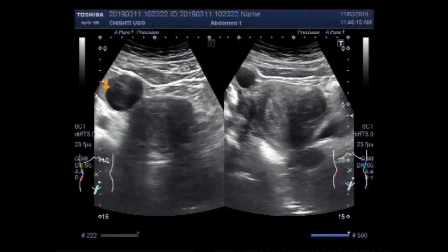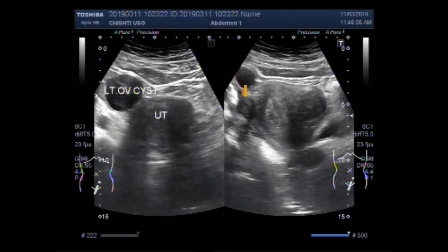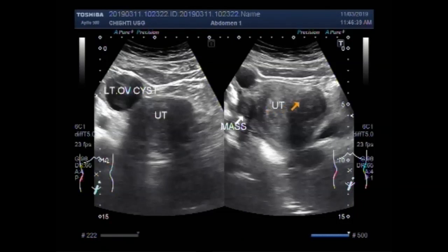Now we label the picture. This is the left ovarian cyst. This one is the uterus, and this is a mass. Smaller mass along the posterior wall. And this is the larger mass along the anterior wall of the uterus.